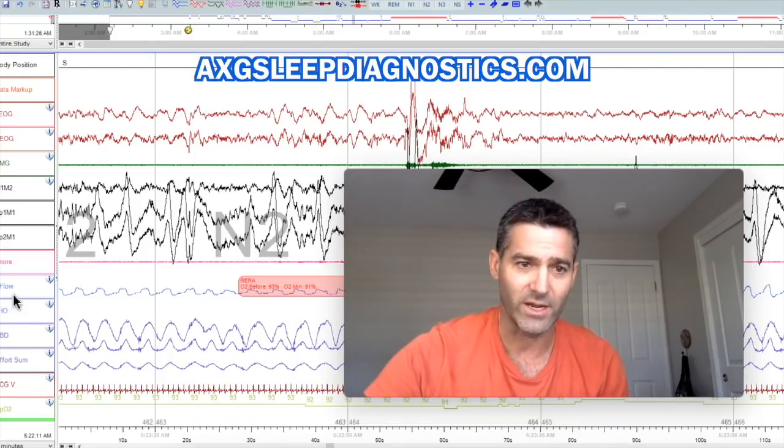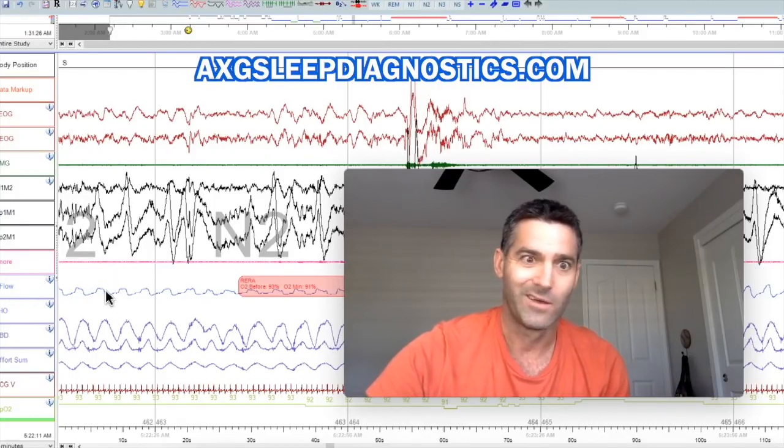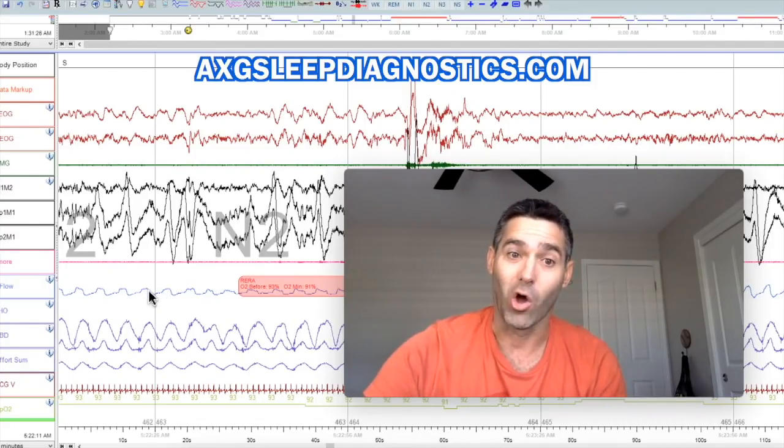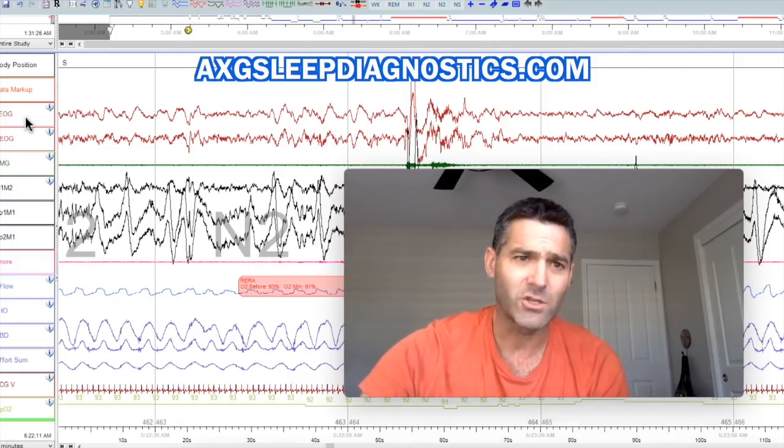And I know all you're looking at is right here. You're looking at P flow. That's really the only thing that Sleepyhead is showing you, other than like the pressure that you're on and some leak values. But more or less, all the information you have is just this P flow line. So let me just go over some of these with you.